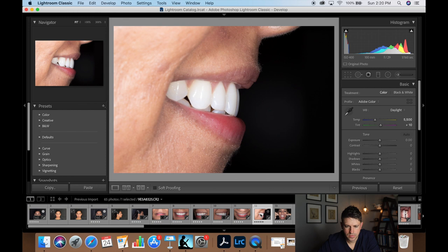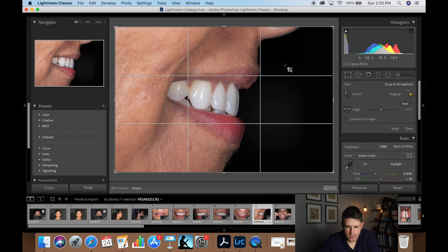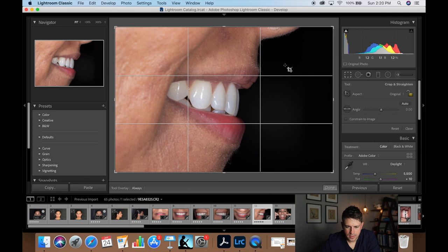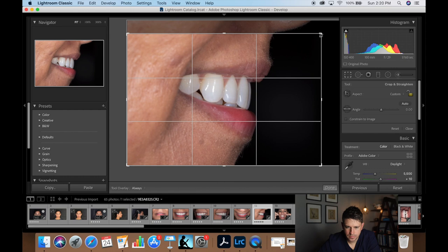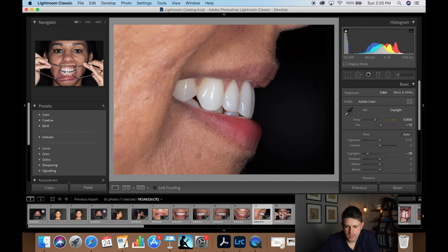Next is our lateral profile smile. Let's dial back the highlights to cover those overexposed areas — that looks fine. I could crop in a little bit here if I wanted to, just like that, and that would be good.